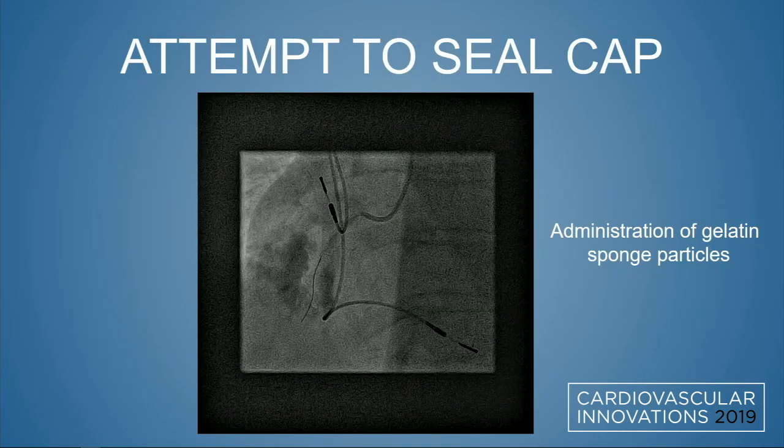And then we intubated the right coronary artery very deeply. We advanced the catheter very deeply in order to prevent backflow of embolization material into the aorta. So we had a damping of the pressure tracings, and we administered 5 to 10 ml of this embolization material.